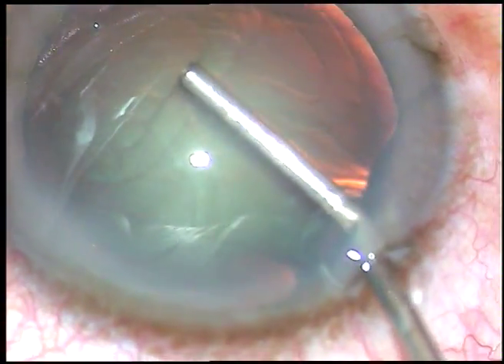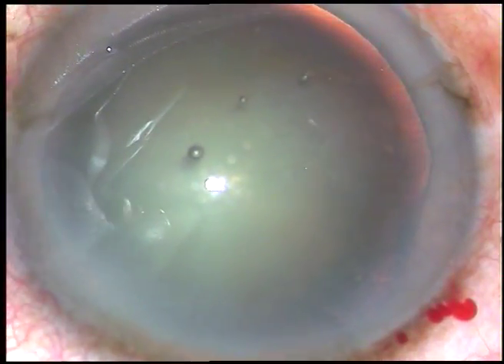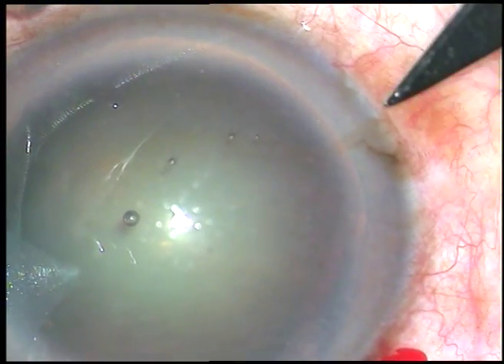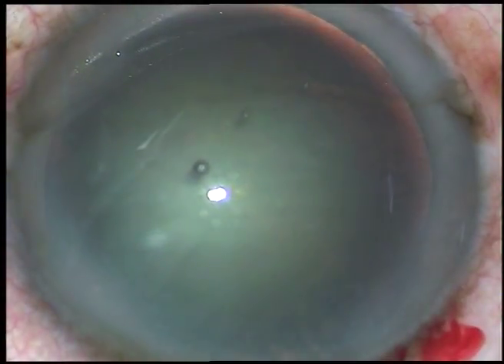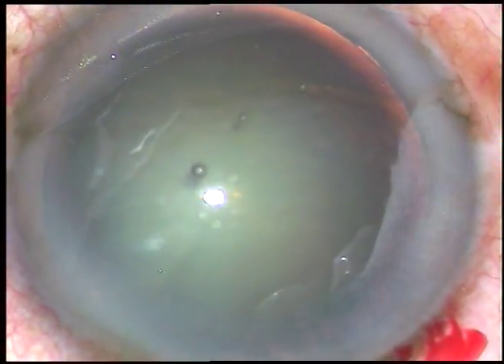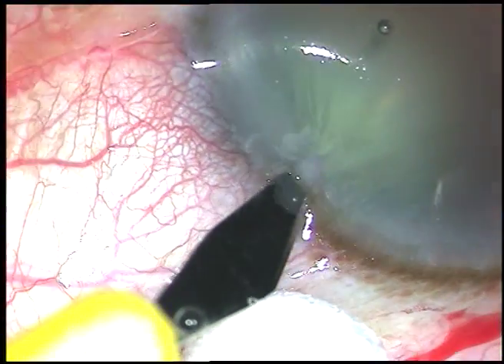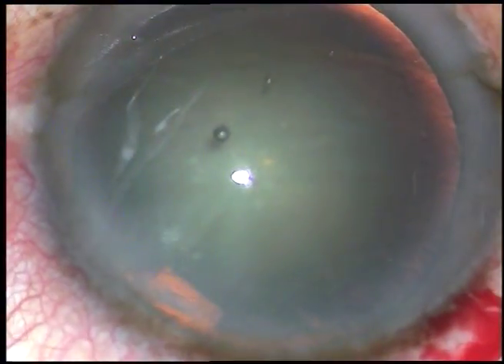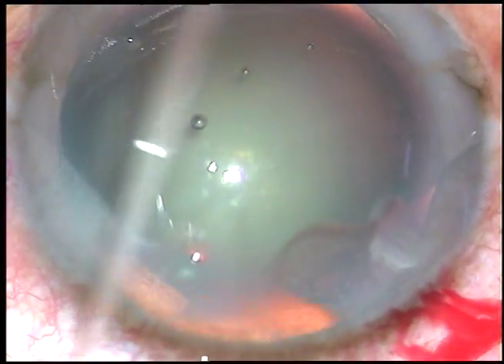By this time the main incision has been made and viscoelastic substance has been injected into the anterior chamber. This is a side port on the right side of the main incision and this is another side port on the left side. The right side port is about 3 clock hours away and the left side port is about 2 clock hours away from the main incision.